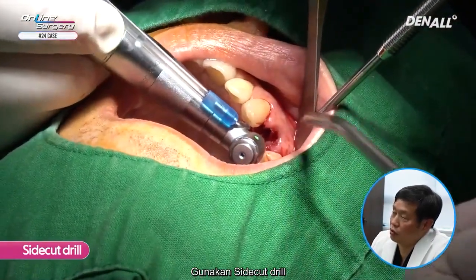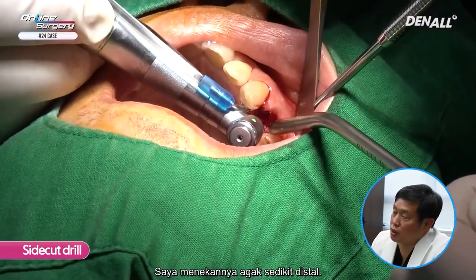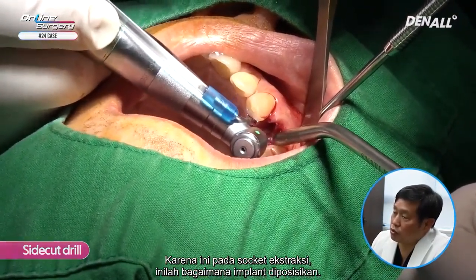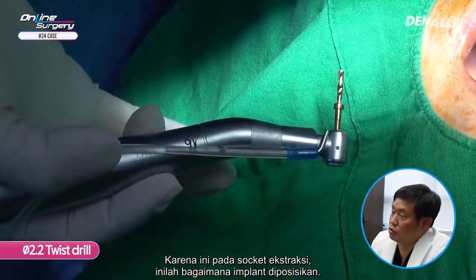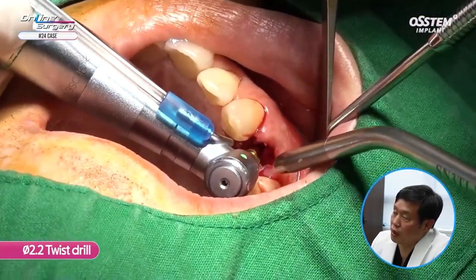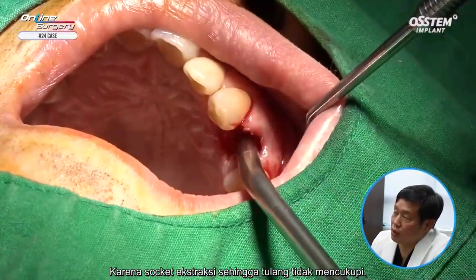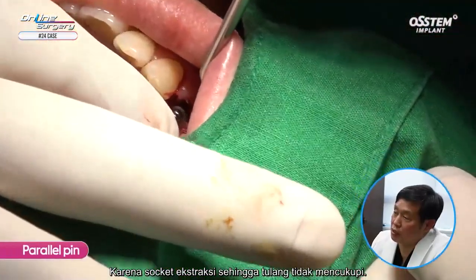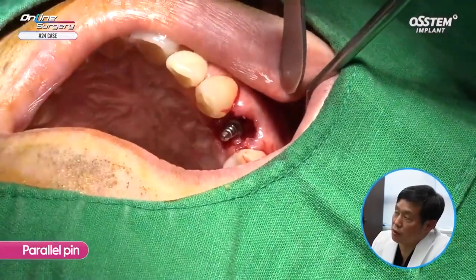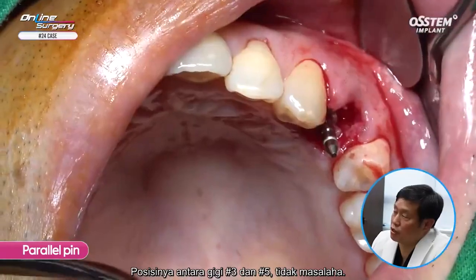Side cut drill is used. I'm pushing it slightly distally. Because it is an extraction socket, this is how it is positioned. 2.2 twist drill is used for drilling. Because it's an extraction socket, the bone is not sufficient. Parallel pin is placed to check the position. The position between number 3 and 5, it's okay.